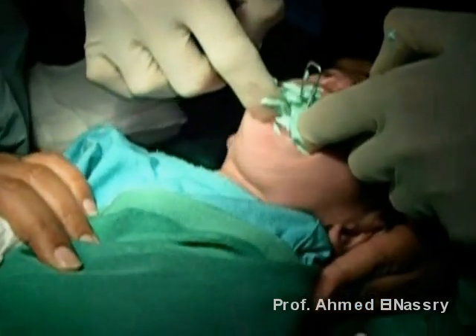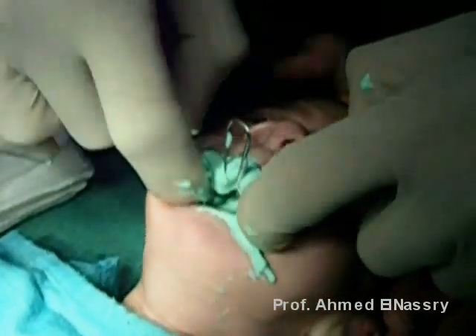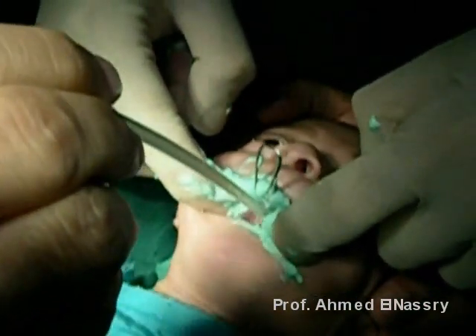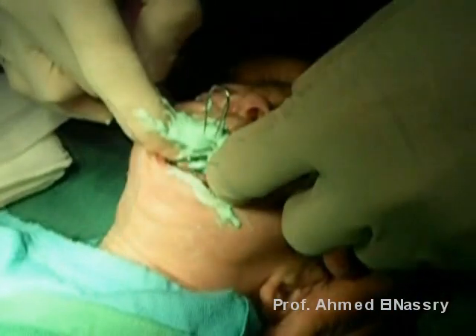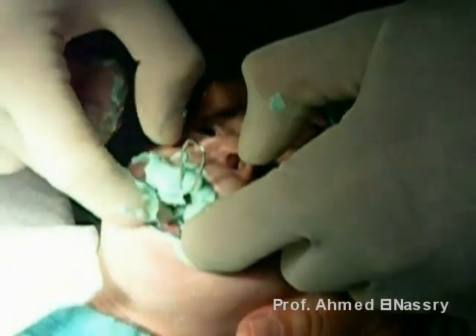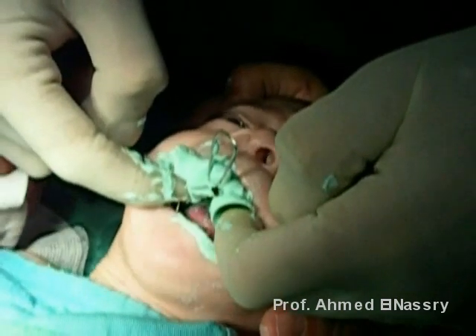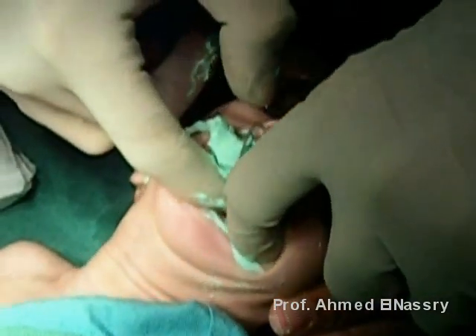Here is Elias during the impression procedure. The safety of the baby is very important — as you can see, suction is ready and the emergency kit is ready. My assistants are helping me, cleaning the face and protecting against any foreign bodies obstructing the airways, to take a nice impression for constructing the feeding obturator.